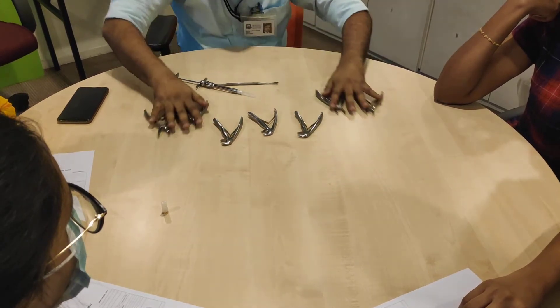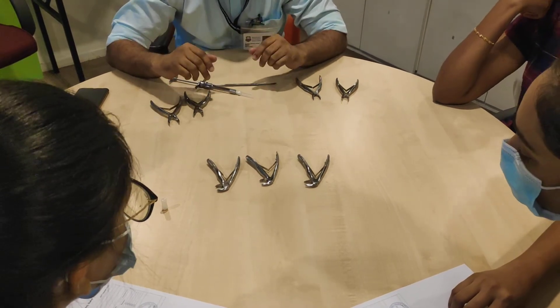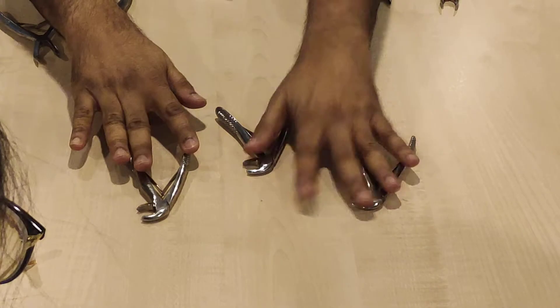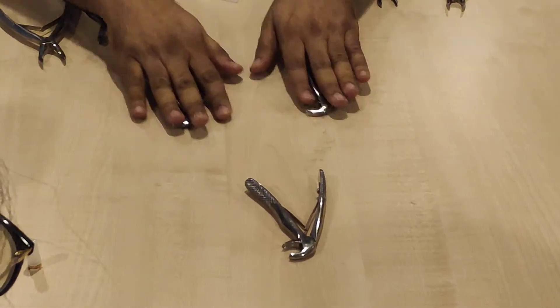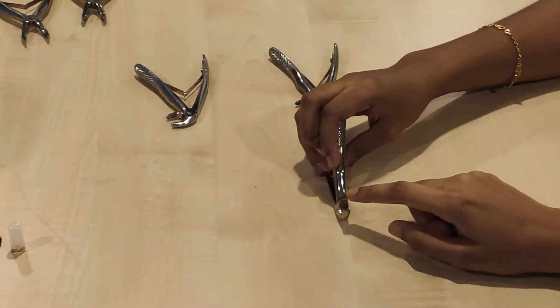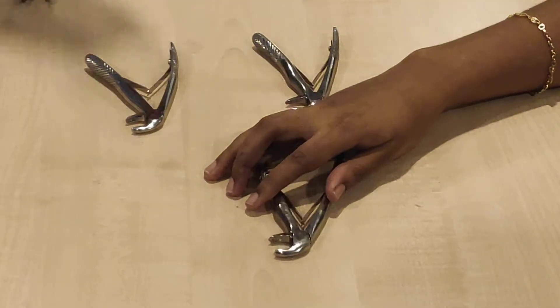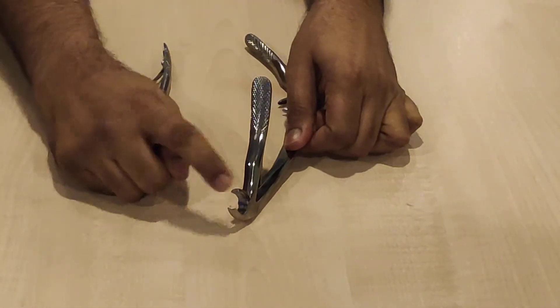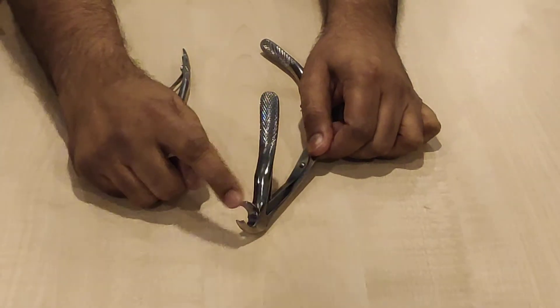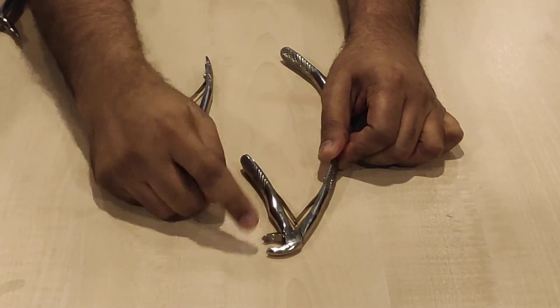Now let's take a look — tell me among all these which is the different one, the odd one out. So this is the odd one. Why? The beaks are thicker and we have this pointy end in the beak. So this is for the molars. Where does this pointy beak go? In the furcation area. That is why — this is for molars.